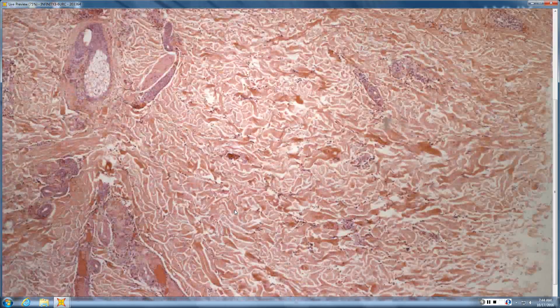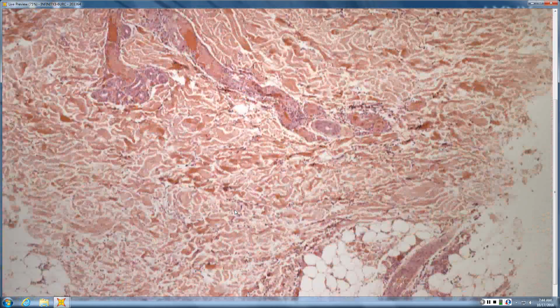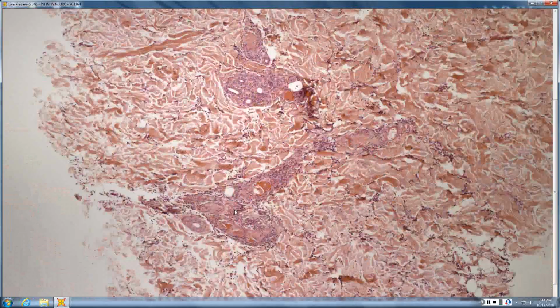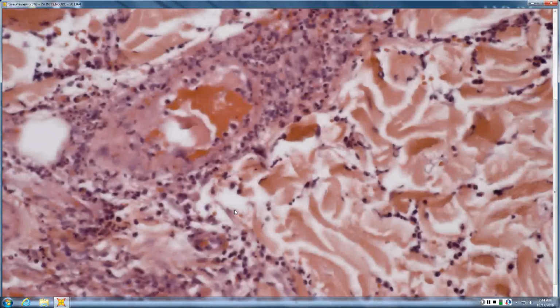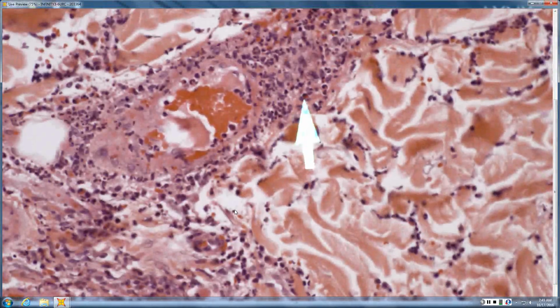So punch biopsy. Looks like a basket woven horn. In the dermis, there's a patchy infiltrate. Looks mostly lymphocytic. A little interstitial infiltrate as well. Okay, periadnexal. Let's see. Ooh, looks a little more neutrophilic, perhaps. Neutrophils and lots of eosinophils.